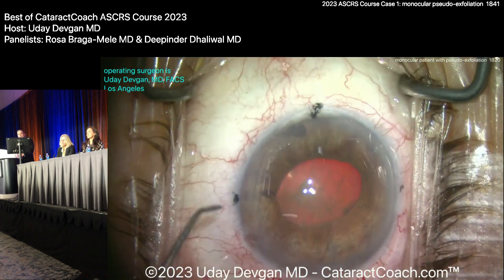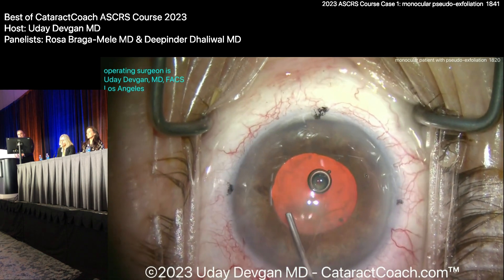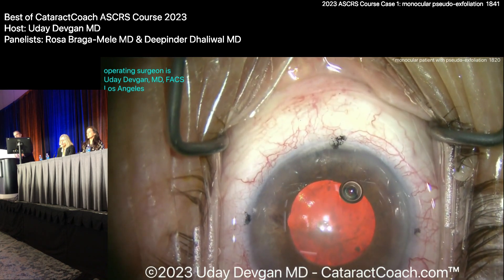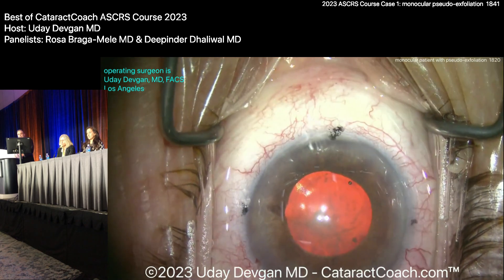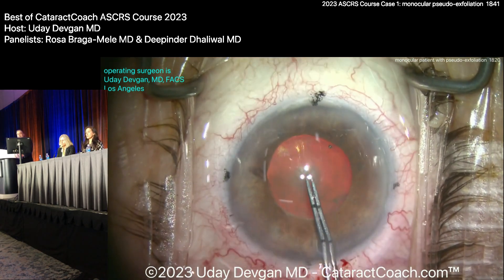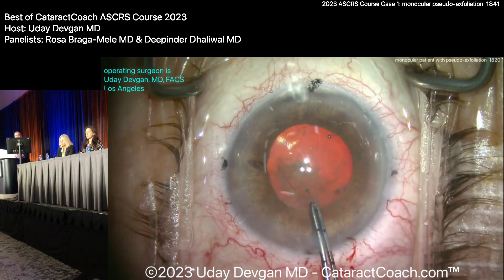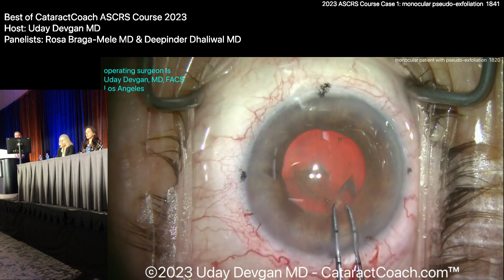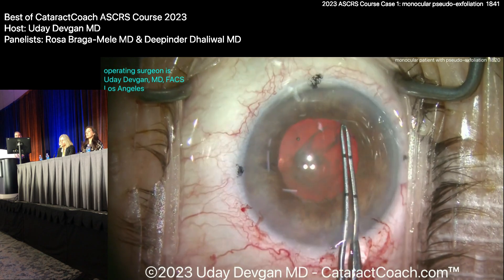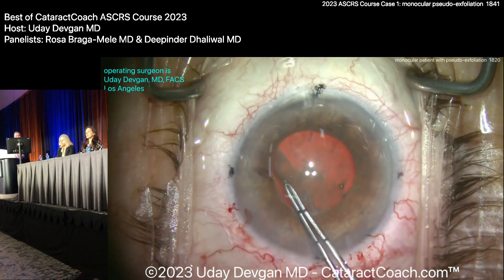Now I'll do Osher's viscomydriasis — push the pupil a little bigger — and I'll get maybe five-ish millimeters now. I'll take the air bubble out so I always have a nice video. Now I'll get the rhexis done, making it basically as big as the pupil, even slightly larger. If my forceps are marked at two and a half to five millimeters at the tip, this is really going to be about a five and a half millimeter rhexis. A nice generous rhexis here, and you can see there's pretty reasonable capsular support. Not as bad as I thought.